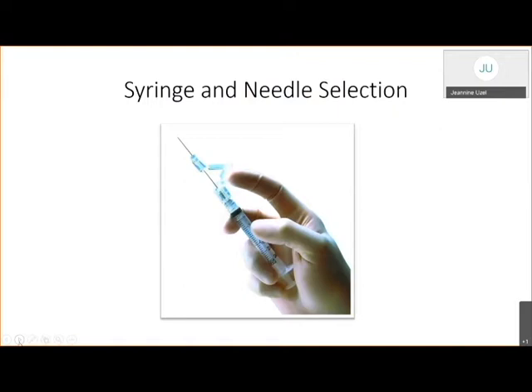Vaccine must reach the desired site for optimal immune response to occur. Use of longer needles has been associated with less redness or swelling than occurs with shorter needles because of the injection into a deeper muscle mass. Therefore, needle selection should be based on the prescribed route, size of the individual, and injection technique. A supply of needles in varying lengths appropriate for the facility's patient population is recommended.